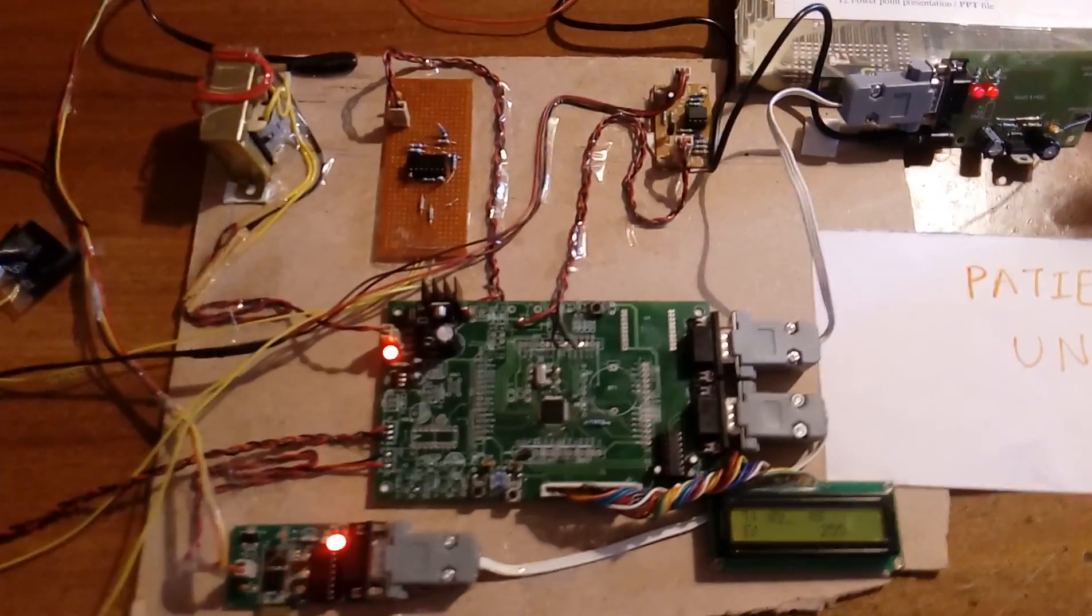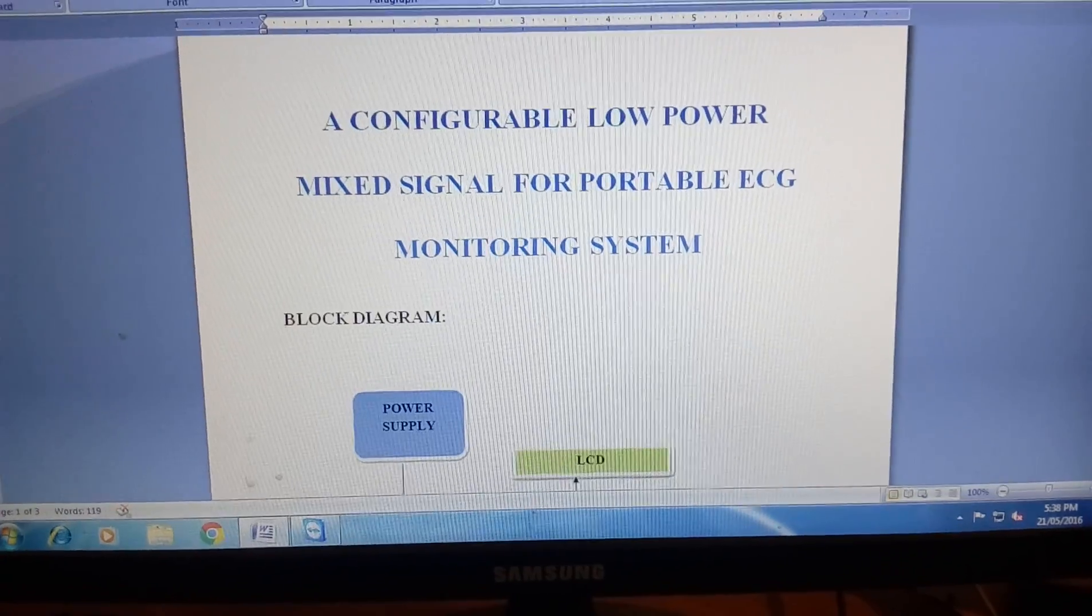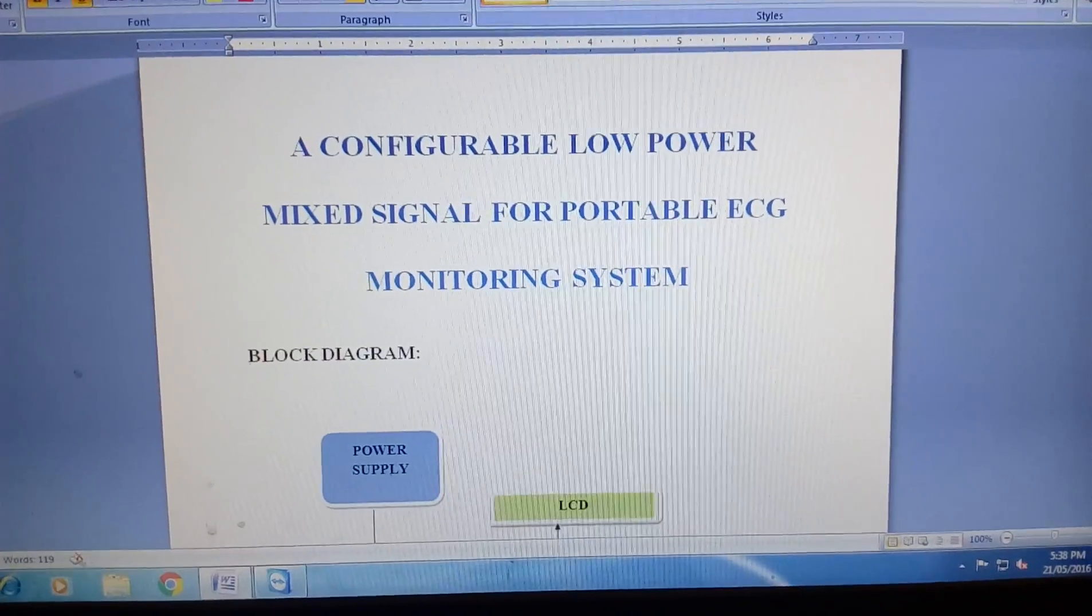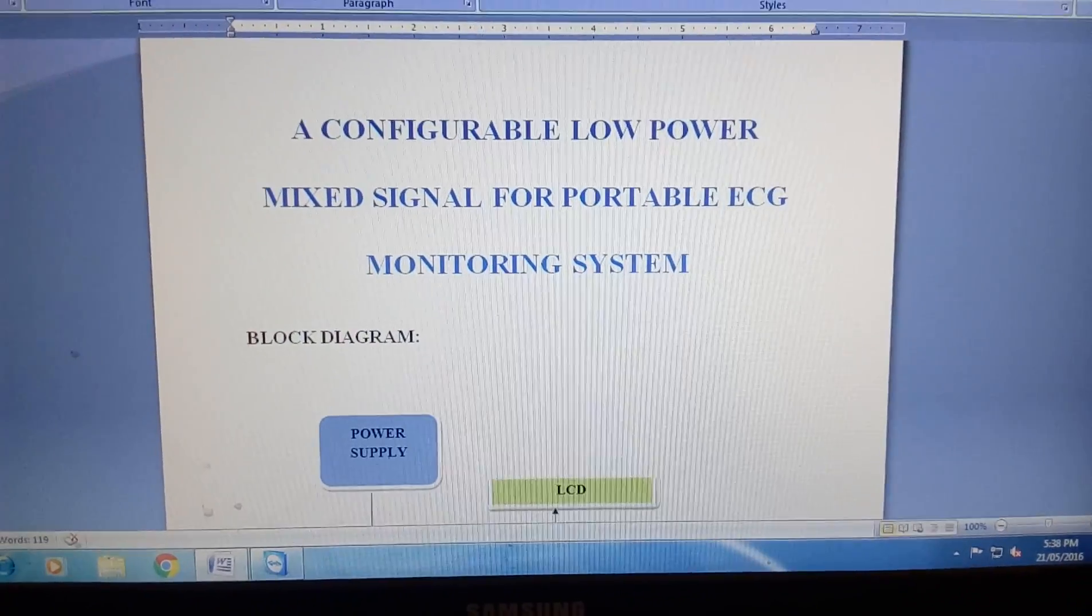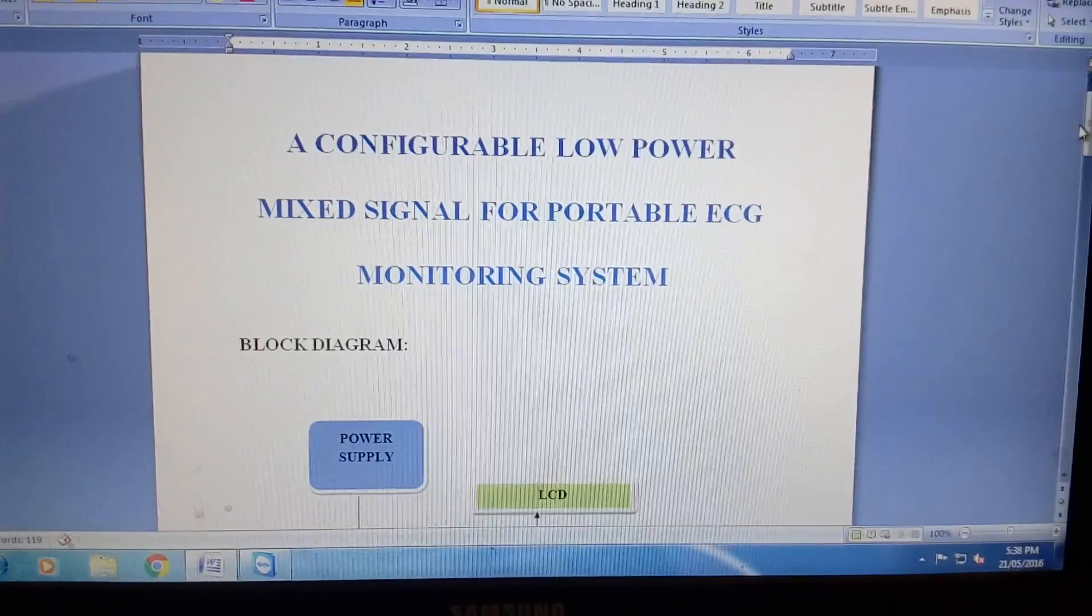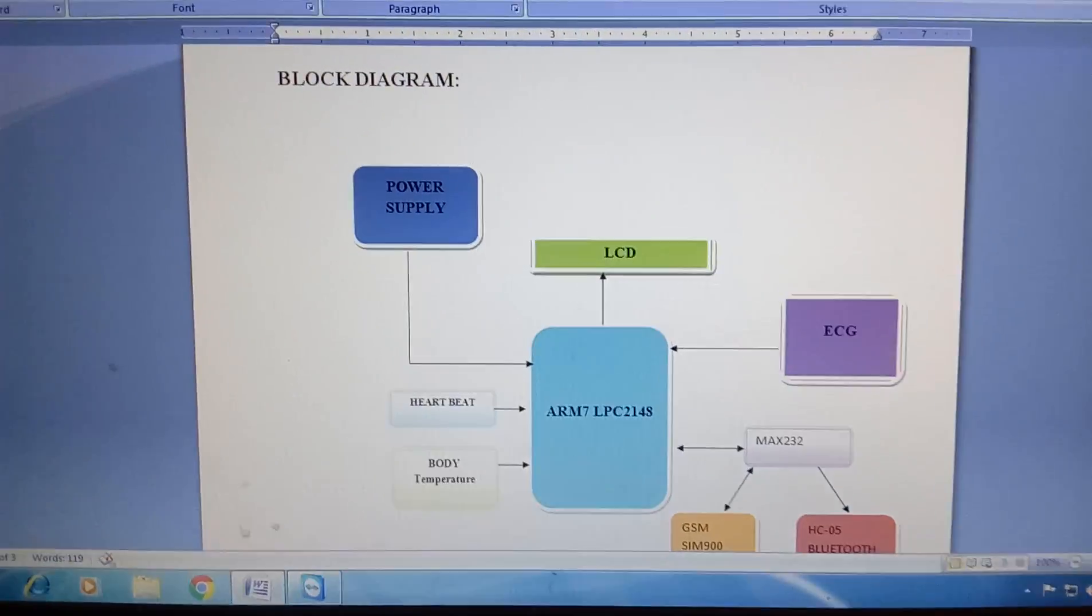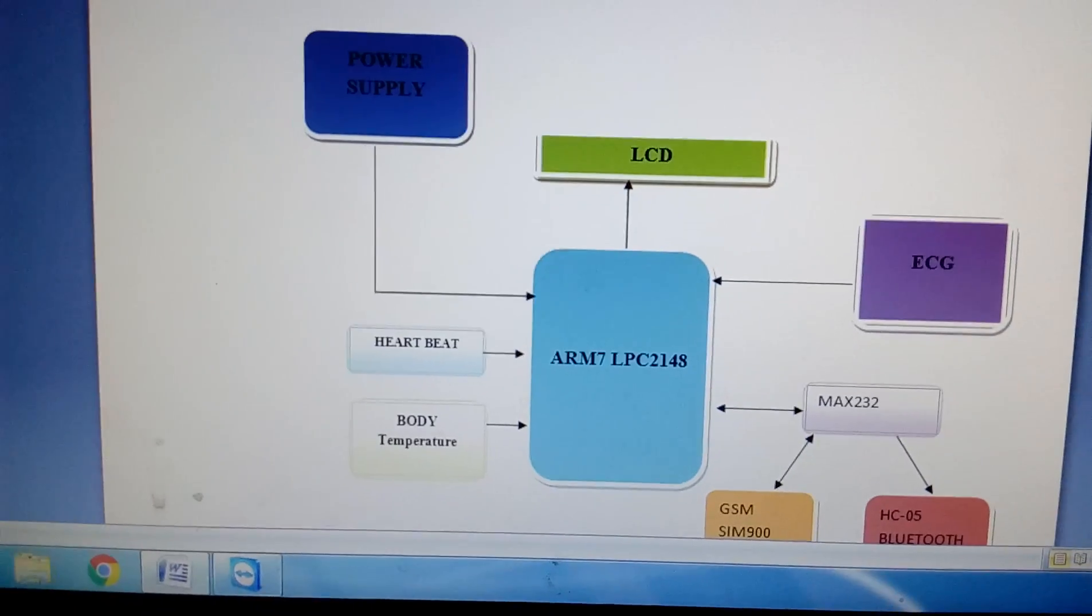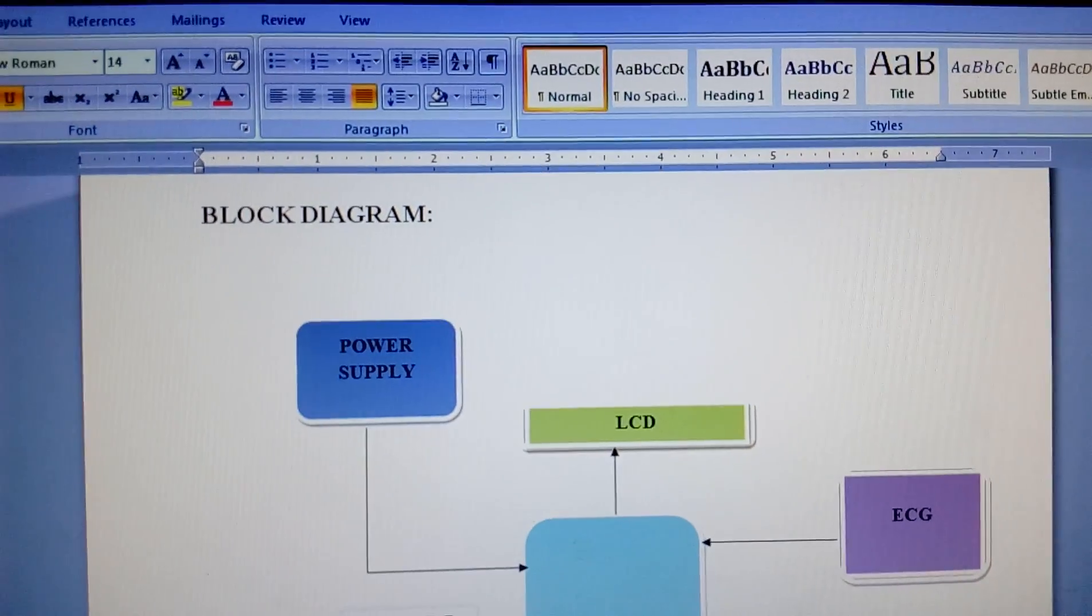Good morning, we are from SVS Embedded. The project title is called a reconfigurable low power mixed signal for portable ECG monitoring system. In this project we are using an ARM7 LPC2148 and we are using one power supply section.